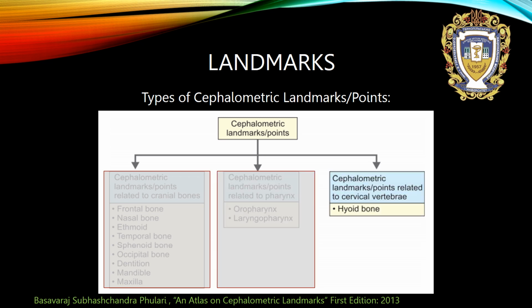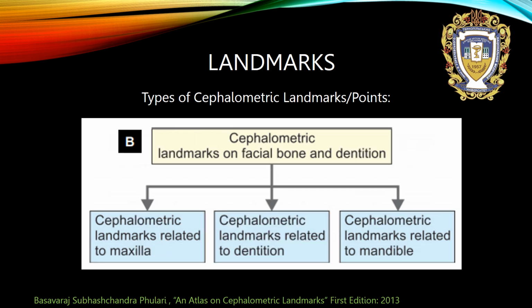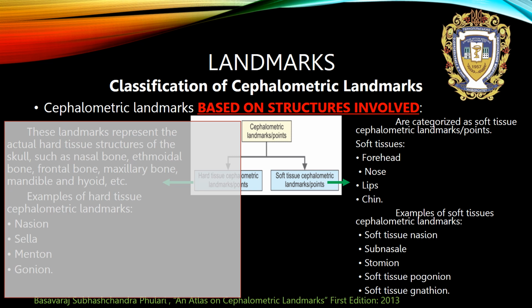Related to pharynx, oropharynx and laryngopharynx, and related to hyoid bone. Landmarks on cervical bones, related to hyoid bone or vertebrae. Moreover, landmarks on facial bone and dentition are divided into those related to maxilla, to dentition, to mandible. And soft tissue cephalometric landmarks.